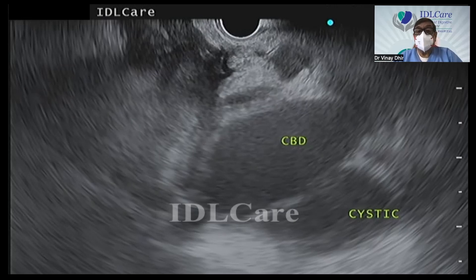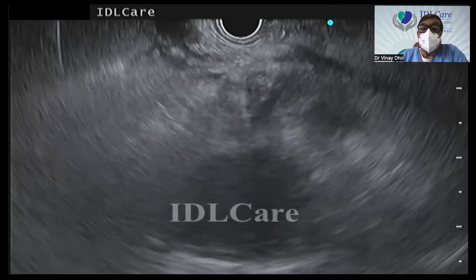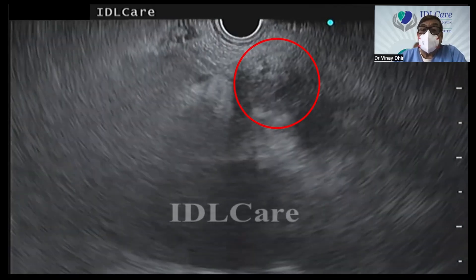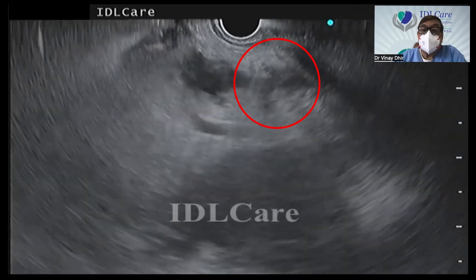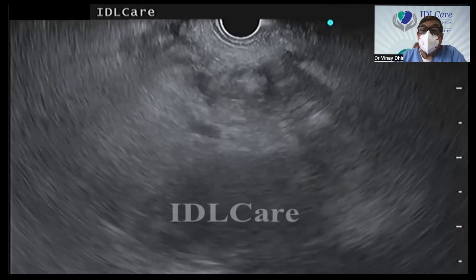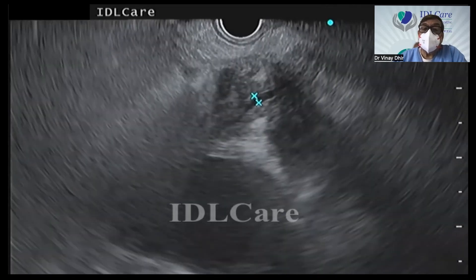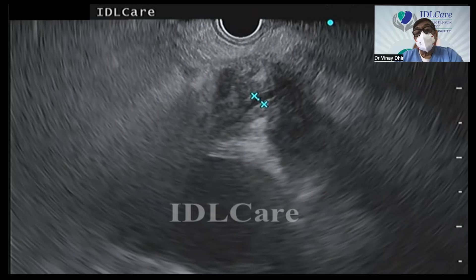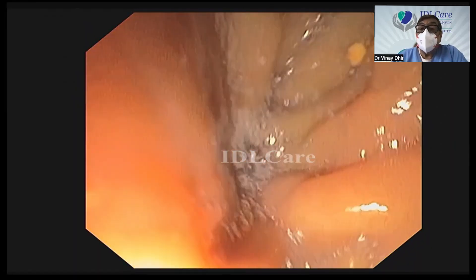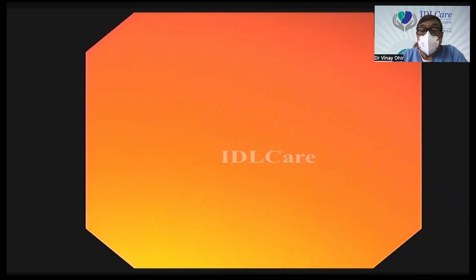The next area of interest would be whether the pancreatic duct is also dilated. So here I am trying to concentrate on the pancreatic duct by turning clockwise. When you see here, we are seeing the pancreatic duct — it is not dilated. This is normal pancreatic duct. So the lesion is only involving the bile duct, so it's a cholangiocarcinoma or an adenoma in the distal bile duct. Let us see.